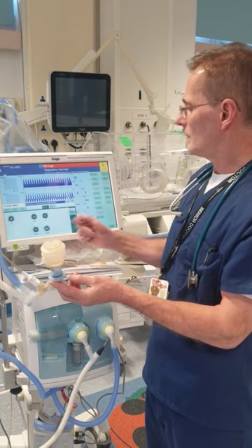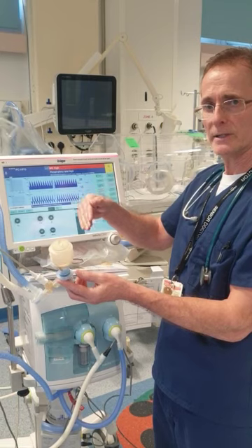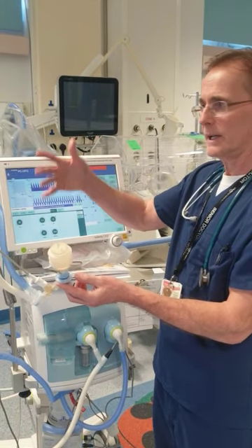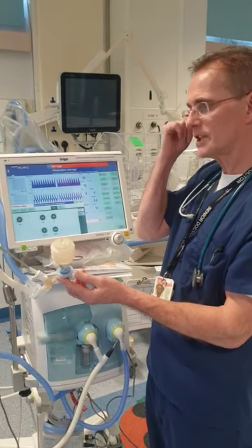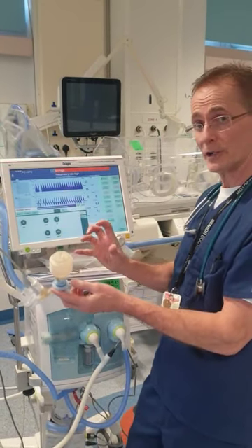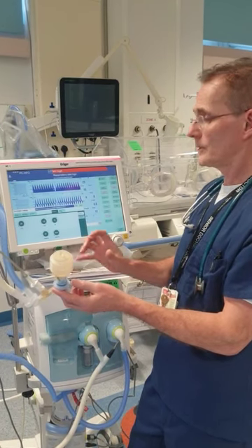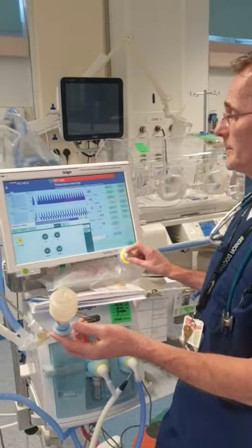Oh, and now let's say at a mean airway pressure of 15, we notice that the baby starts to desaturate, and the saturations go from over 96%. Oh, they're going down to 88%. That tells me at a mean distending pressure of 15, the lungs are starting to close. So what I'll do when I see that, well, I'll turn up the oxygen just so that I don't let the baby desaturate.